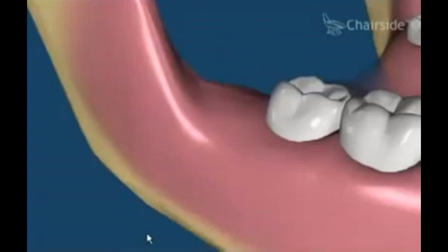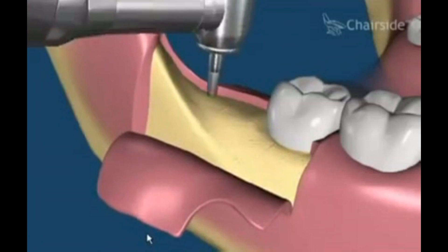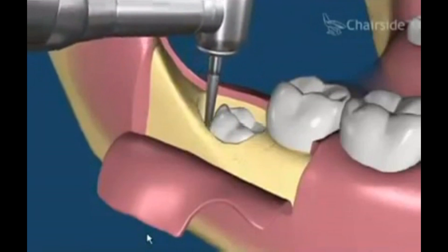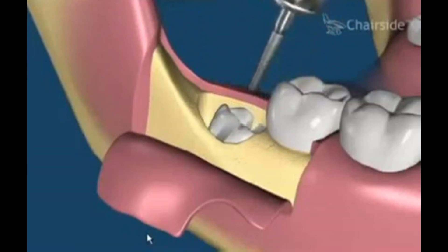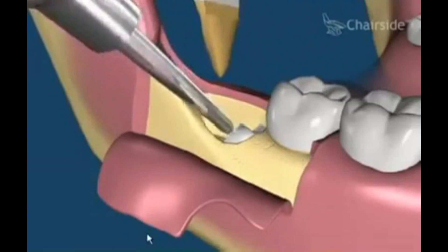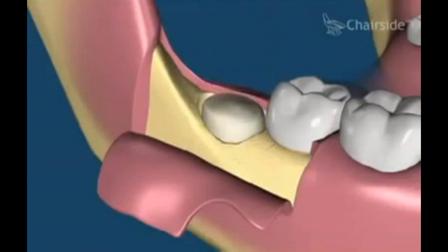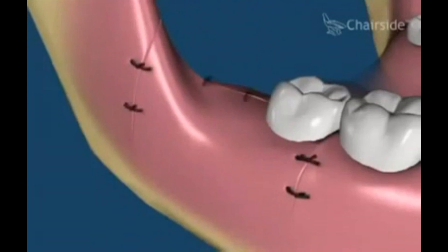This movie shows an impacted lower wisdom tooth in a full bony removal situation. We first raise a flap. Since the tooth is completely covered with bone, significant bone is removed to gain access to the tooth. Then we section the tooth. The tooth sections can then be removed with elevators. A bone substitute can be placed in the socket to aid in healing. The flap is repositioned and sutured, the sutures dissolve, and the area heals.